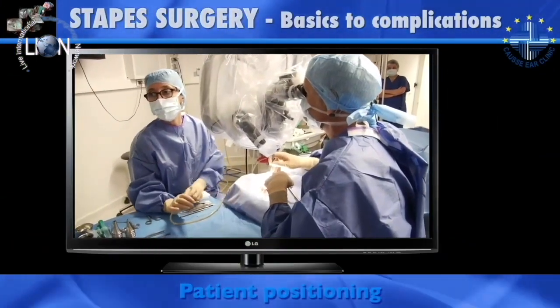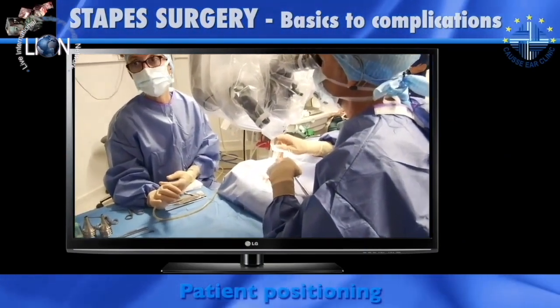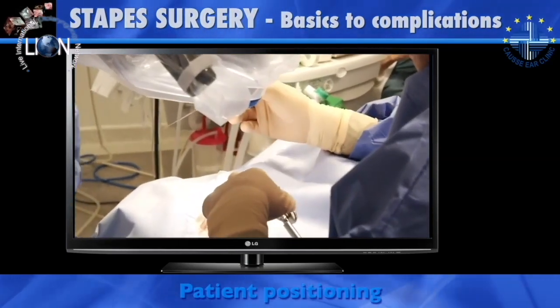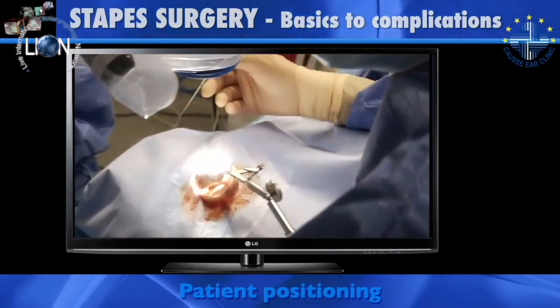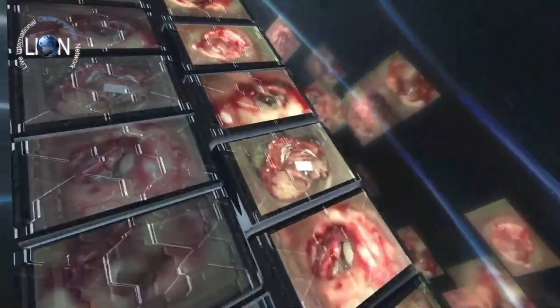Now, let's go to some words about the patient positioning for transcanal approach. You see the nurse is in front of me, and the patient is strictly perpendicular to me. And I'm using, that's important, a speculum holder to give both hands free like this. And this is kind of a platform. There's a plate underneath the head of the patient and the two joints to fix the speculum. And this will stabilize, of course, the speculum in a nice way.